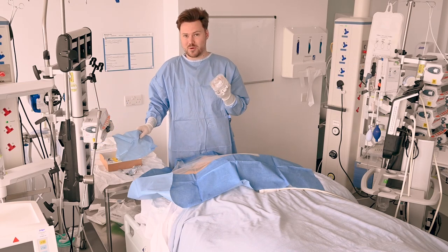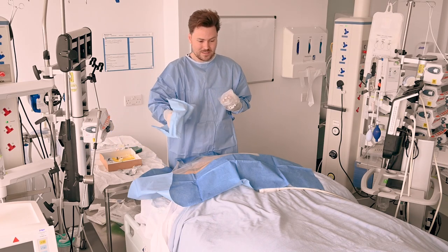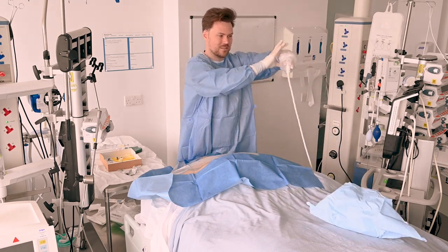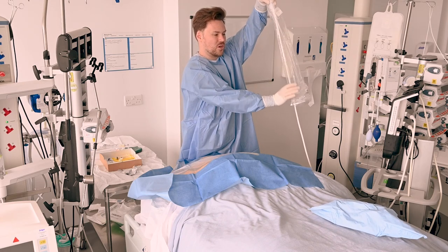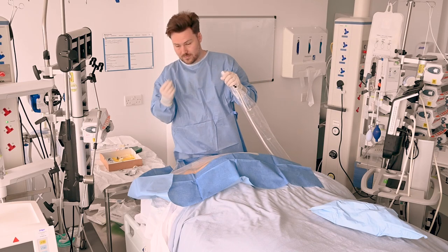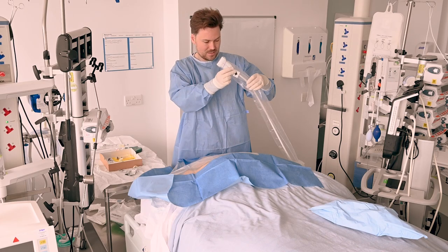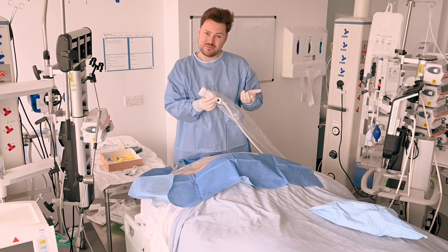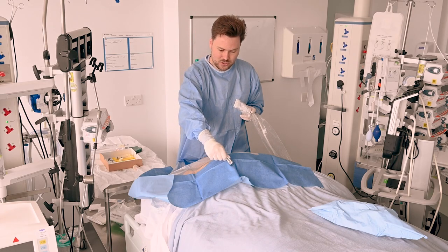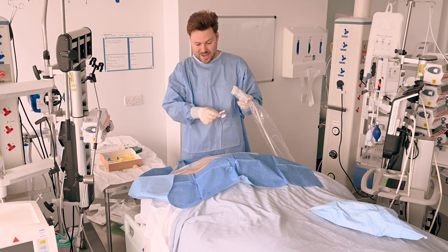If you've got an assistant you can then ask them to pass you the probe cover. However, a little tip if you don't is to use the sterile field that the probe cover came in to pick up your probe and pass it to yourself. This can then be discarded and the probe cover pushed over the probe, meaning that you stay sterile the entire time. One rubber band over the end and make sure that the air is out. You can attach additional rubber bands or tape if you need to, but generally I find I don't need it. The rest of the ultrasound jelly I put at the top of my sterile field — this way I don't have to reach across to get it and when it's messy I'm not going to get it on any other part.